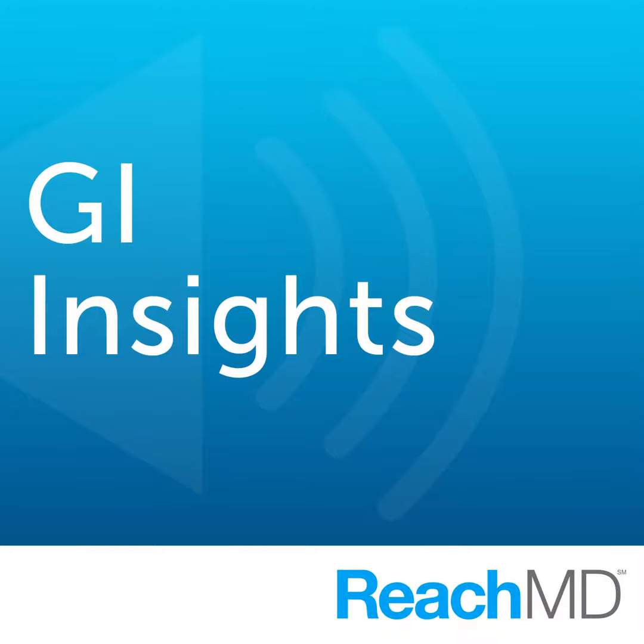Let me ask you though, when you're characterizing or thinking about a patient referred to you for a balloon dilation, who are the patients you kind of outright know are not going to be candidates? Depends on various factors. If the length of the stricture is 10 to 12 centimeters, I know endotherapy will not help them. I probably will be putting them through a risk of a procedure, a risk of perforation and bleeding without much added benefit.